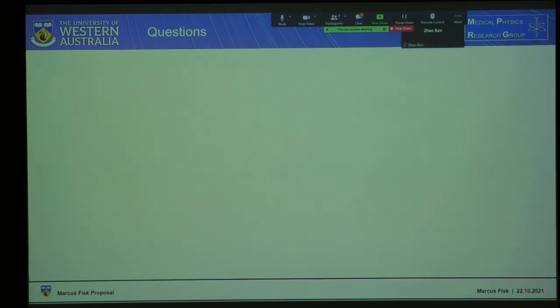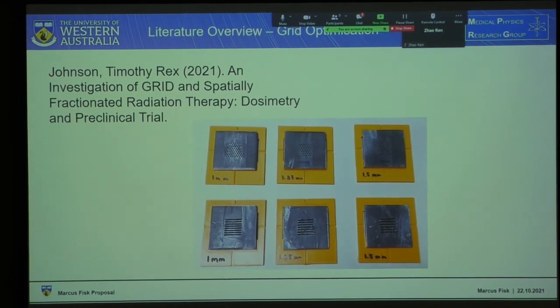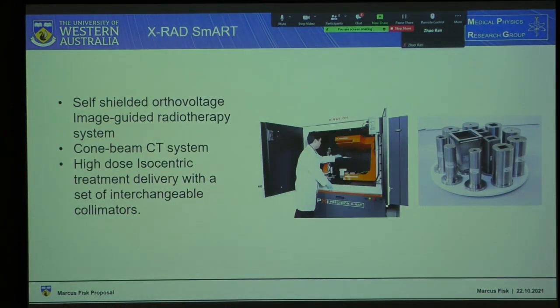The amount of Cerebend used in this paper here is exactly what I'm going to be using, and it produced far better peak to valley ratios than MV beams. So the thickness of the collimator setup is going to be this one here. That's basically the thickness of the Cerebend, and that'll be enough to produce the required result, but maybe we'll even go thinner than that.